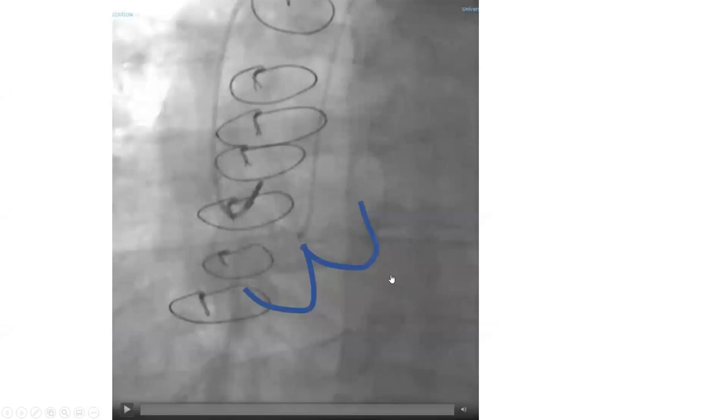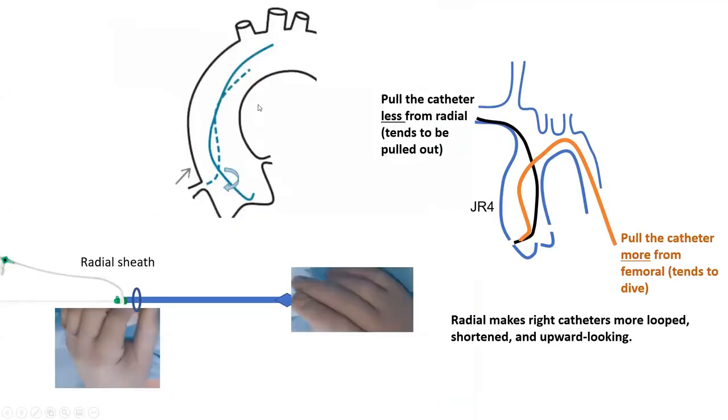Let me talk a little about right coronary engagement. For right coronary, you go down to the valve — you need to be in the right coronary cusp — then you pull and clock 90 to 180 degrees in one maneuver. Both hands on the catheter, you pull and clock in one step and try to engage. The difference with femoral: the catheter tends to dive down, so you need more pulling from femoral. Whereas from radial, the catheter tends to be pulled up more, so pull less from radial than from femoral. That's why fellows used to radial struggle when trying to engage the right coronary from femoral.